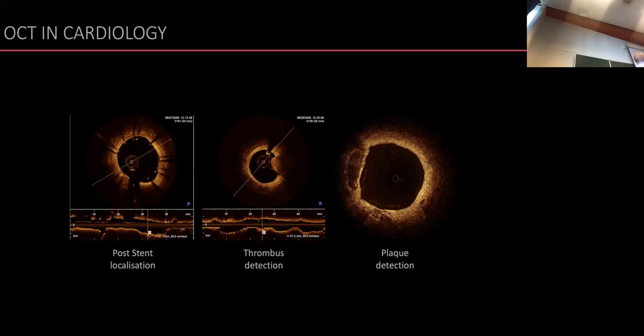Okay. Yes, better. So within the OCT data set, if you make this lighthouse probe-based images, within the tube, within the artery, you could see these kind of things. Which is a lipid pool with a very thin cap on top of it, and the thickness of the cap determines what kind of treatment the patient will get. You can imagine if it's too thin, there's a high likelihood of rupturing into the bloodstream, so you get all the issues. But the killer application is post-stent localization.